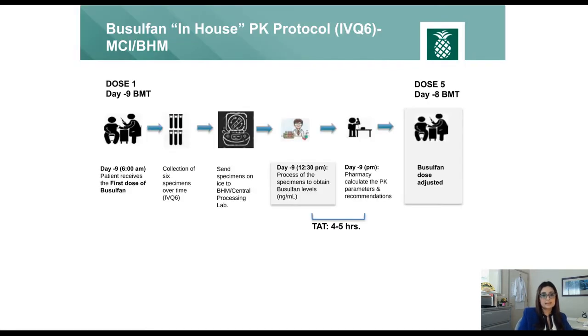On the other hand, the busulfan quantification in-house is performed the same day of sample collection, with fewer technical difficulties, less risk for the patient, and much better turnaround time. The busulfan in-house testing allows pharmacists and physicians to get results faster and to adjust the dosing before the 5th dose series begins.